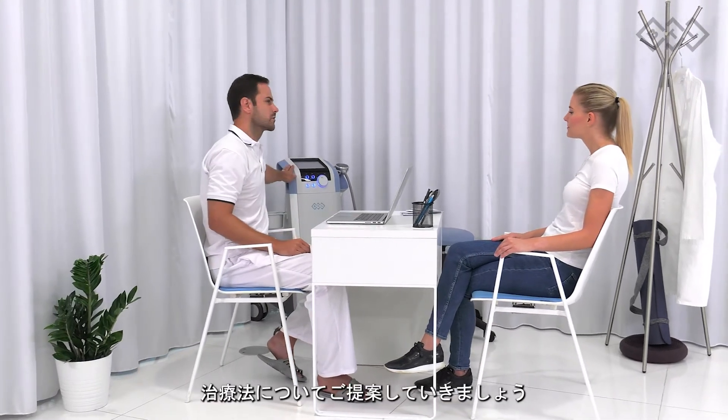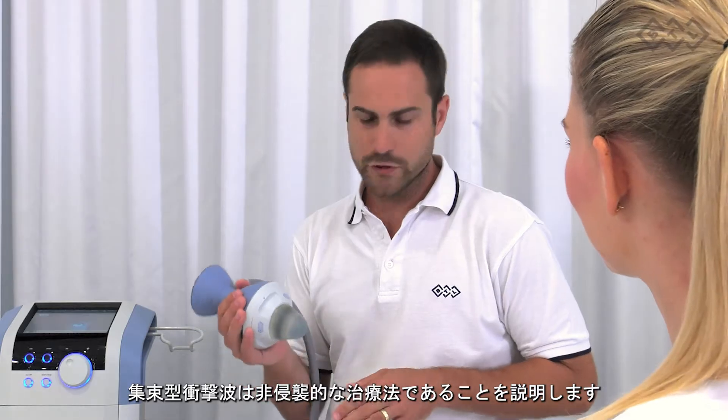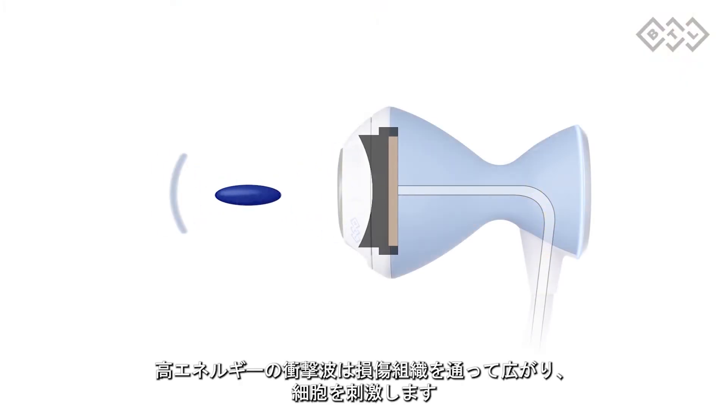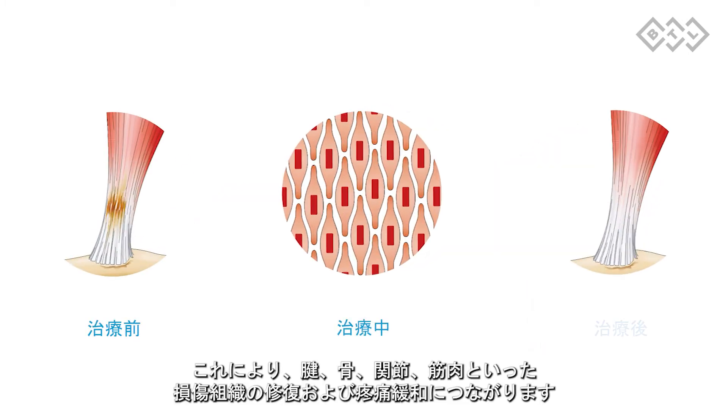Offer the solution. Explain that focused shockwave is a non-invasive method. High energy shockwaves spread the energy through damaged tissues and cause cell stimulation. This leads to the reparation of damaged tissues such as tendons, bones, joints, muscles and pain relief.